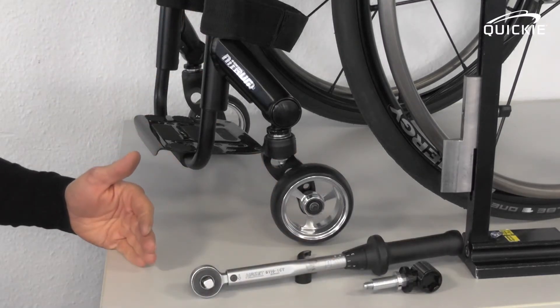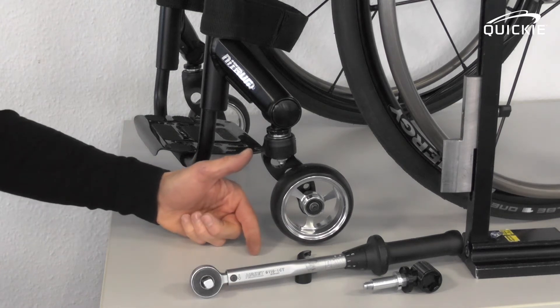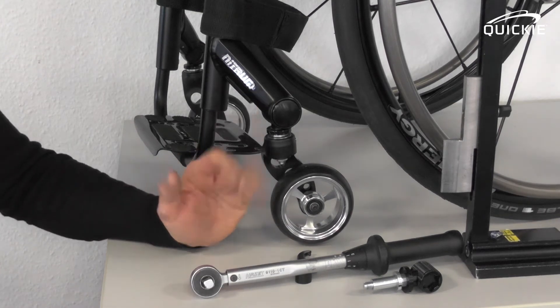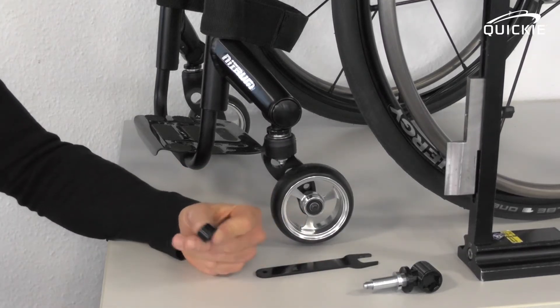You will always have to follow both procedures in a row: first adjusting the caster height, and then adjusting the lateral caster angle. Let me show you how it works.